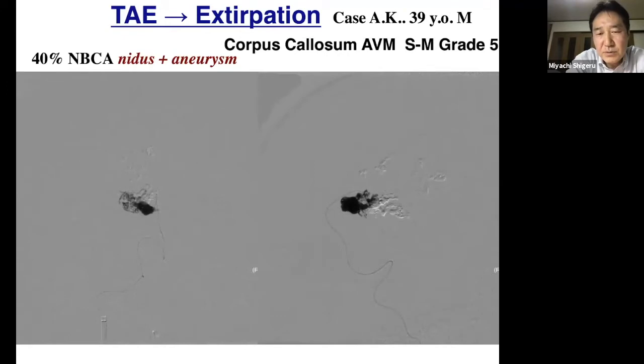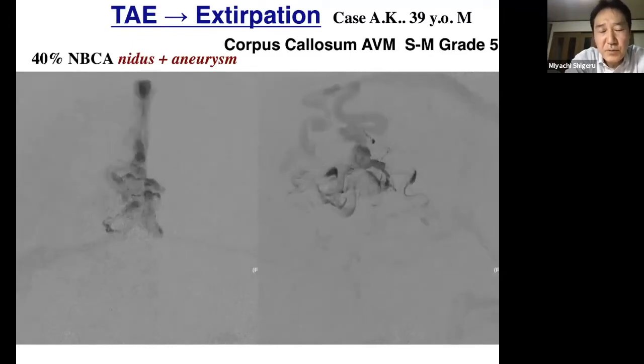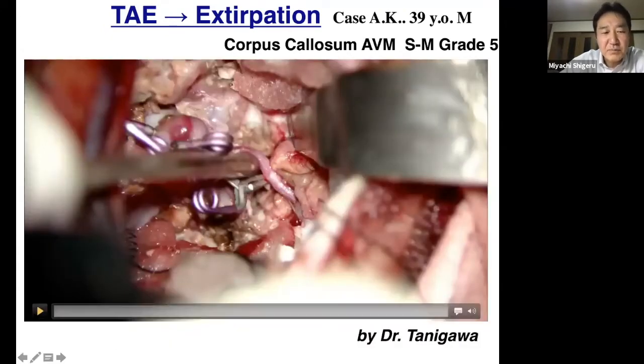We repeated this procedure 14 times. This is after the embolization: 14 feeders in one session. This is a very crazy way, but the next day Dr. Tanigawa wanted to operate. Anyway, this is the operation.